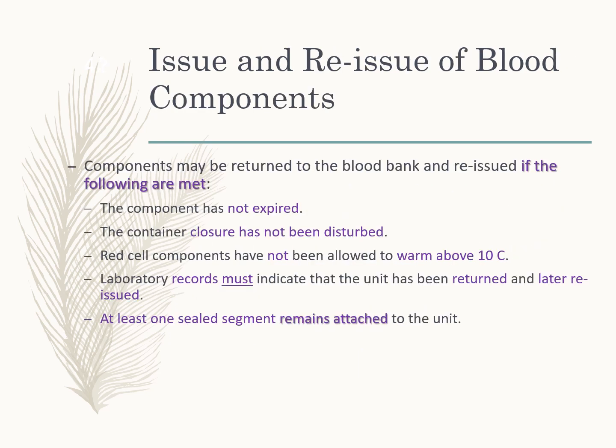So what happens when a nurse picks up an RBC unit, takes it back to the floor, and she finds out the patient was released from the hospital before she was able to transfuse the unit? Those units can be returned to the blood bank as long as the component has not expired, the closure has not been disturbed, the red cell components have not been warmed above 10 degrees, and the lab records must indicate that the unit has been returned and later reissued.